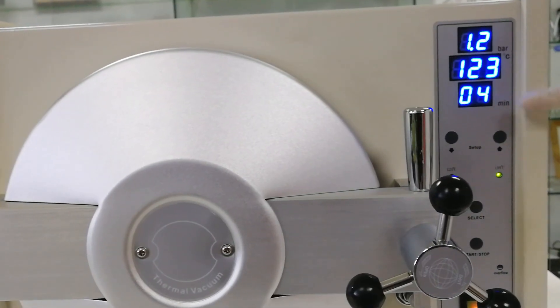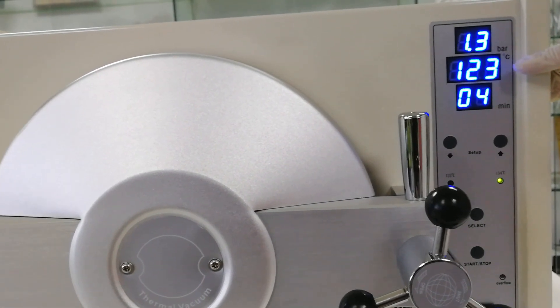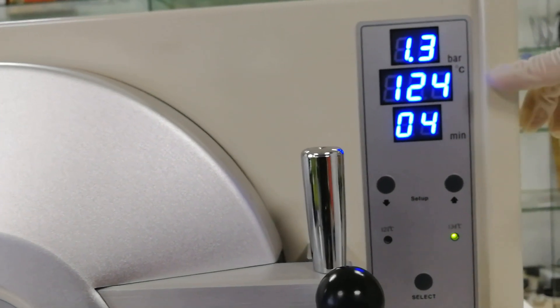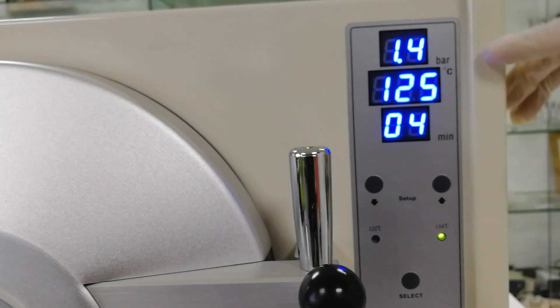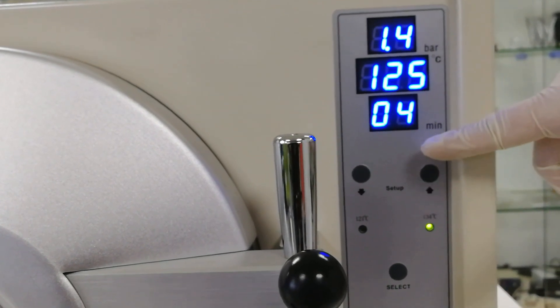The autoclave temperature keeps rising — now at 123°C and about 1.3 bar. We are waiting for it to reach 134°C. At that time, the sterilization timer will start.